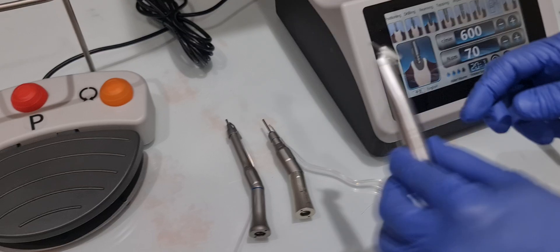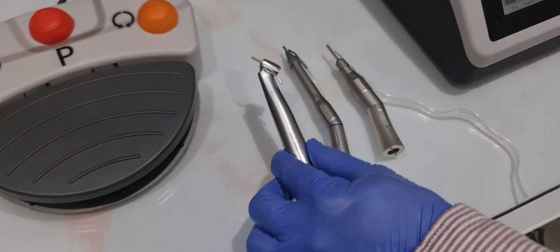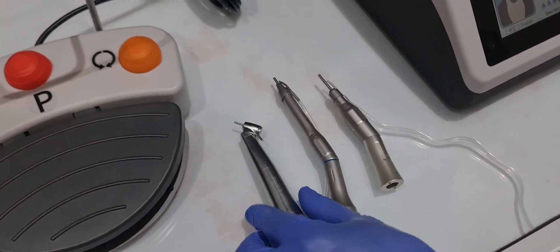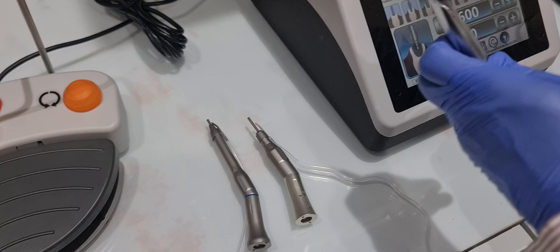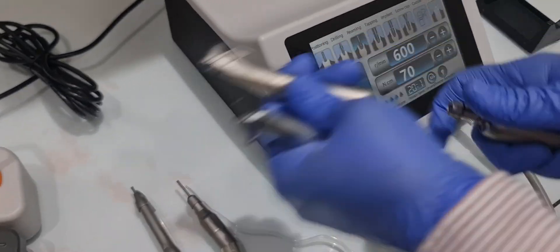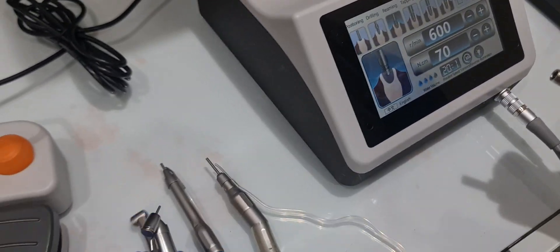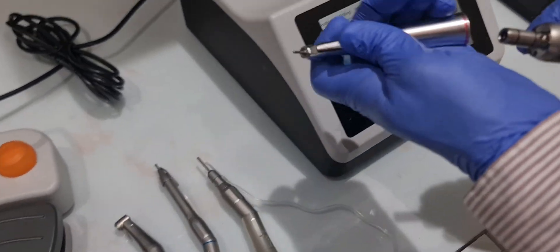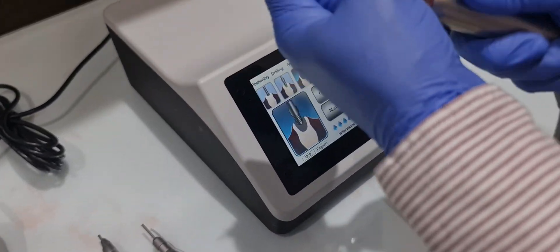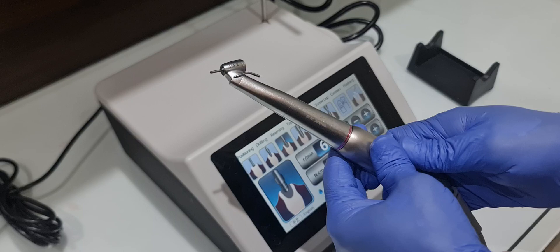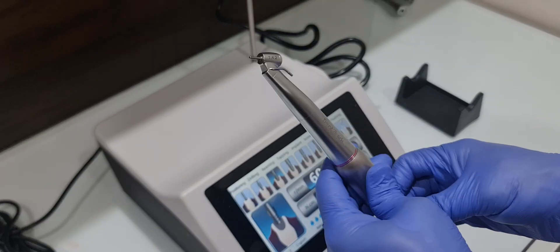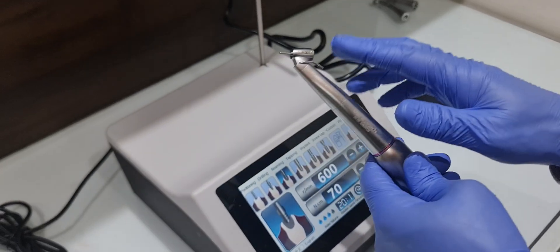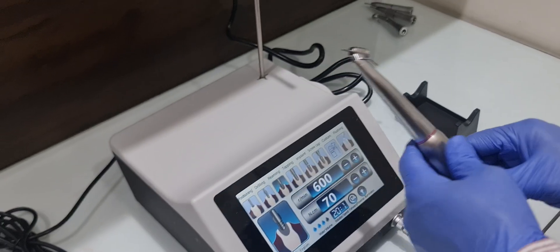And this handpiece is 1:4.2 increasing contra angle. This also can be used for bone surgery. This is also fiber optic.